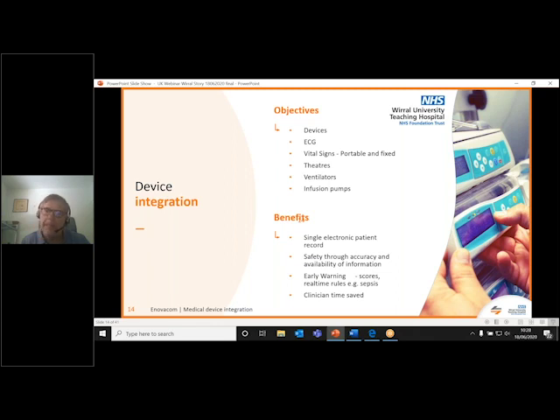And we are starting a project for infusion pumps outbound into the patient record to help with fluid balance. We're not quite brave enough to go with a two-way infusion pump, and we will start that in the neonatal unit, where a huge amount of time is spent with highly specialized nurses sitting next to infusion pumps, noting down the readings.